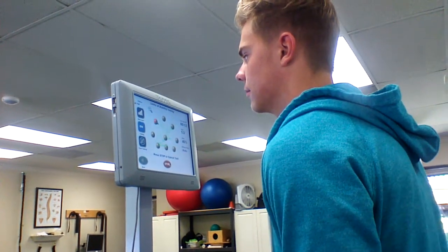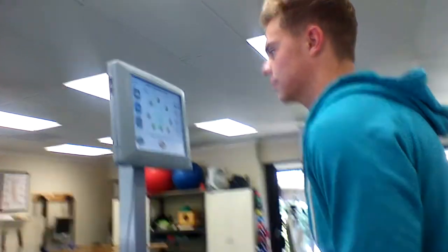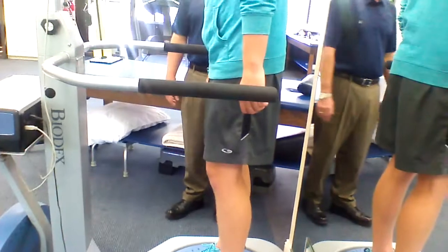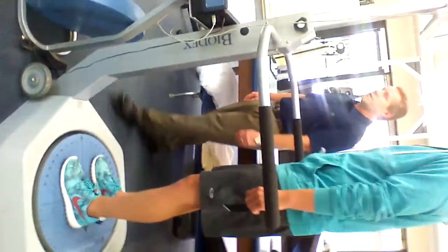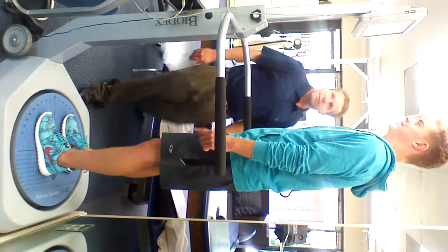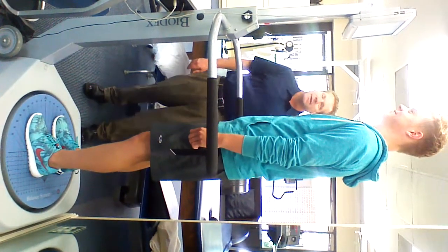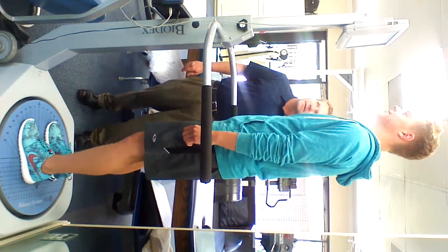You want to try to do it as fast as you can. Takes a little bit of practice. You're trying to shift your head instead of shifting your hips — most people do that at first. There you go. It is weird.